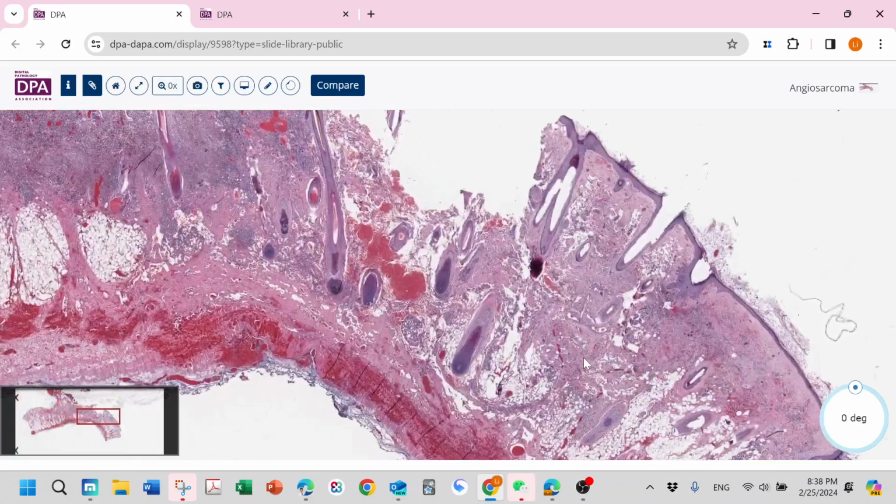And you need to also be really cautious if you have a lesion that looks like a vascular lesion but is not really classic for angiosarcoma, and when you do the immunostaining, CD31 negative, ERG positive, and you would like to call this angiosarcoma, you need to be really cautious, because I happened to have a case that is myeloid sarcoma. For this myeloid neoplasm, they may have ERG positive. So always do not rely on one marker to make your diagnosis.